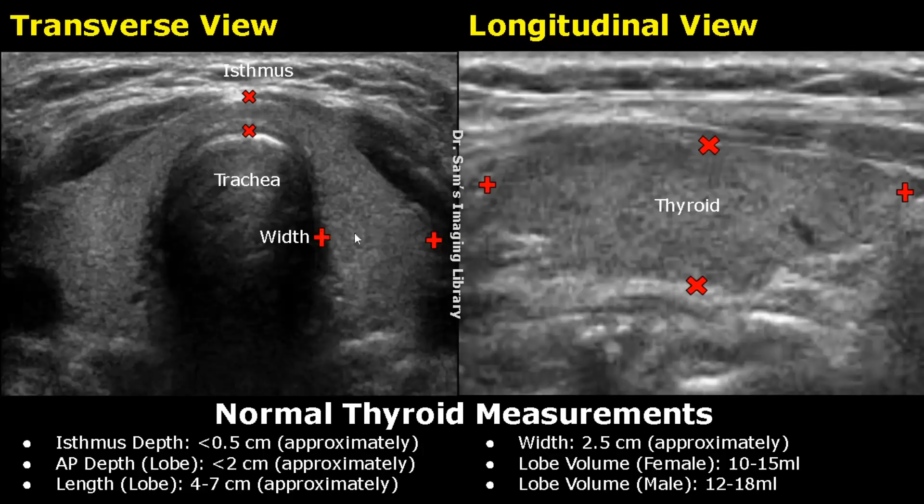The width of each lobe can also be measured by placing the calipers horizontally across the lobe in transverse view. The width is approximately 2.5 cm.